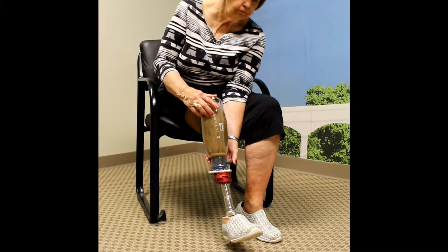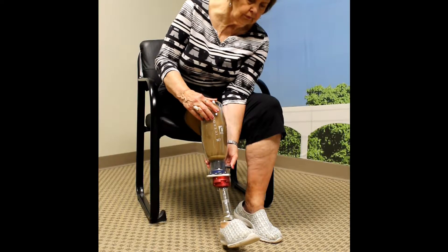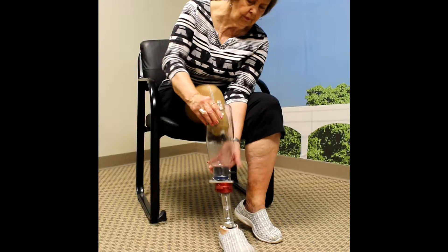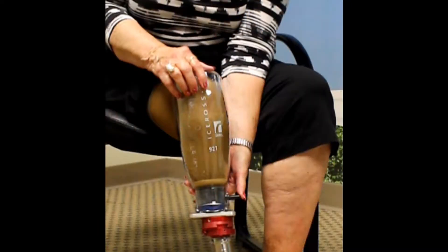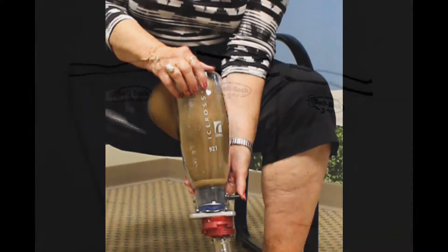To remove your socket, depress the button located near the lock mechanism and hold the button while pushing the prosthetic away from your leg. It is important to note that the button must be depressed until the pin is completely disengaged.